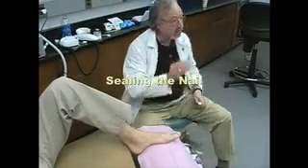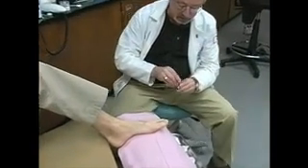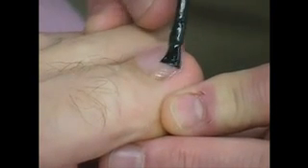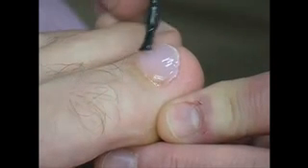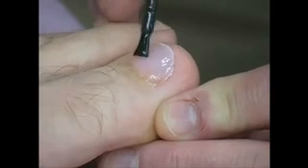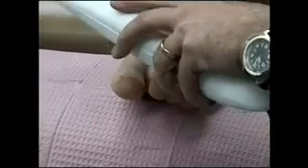Now for the seal, you're going to use the same black brush that you used when you put on the resin. The white brush is only when you're putting on the bond. With this, you're just putting a very thin layer on, really just a coating. I usually start at the posterior nail fold and just pull it forward very lightly. And that's it. I'm just thinning it and trying to smooth it out evenly here. And that's basically the last step.